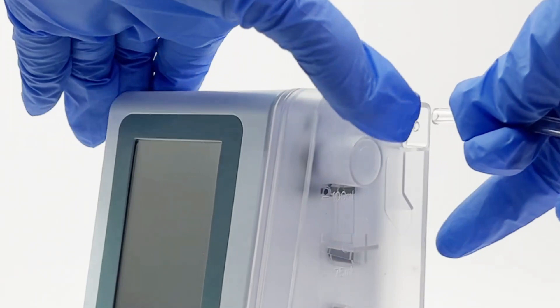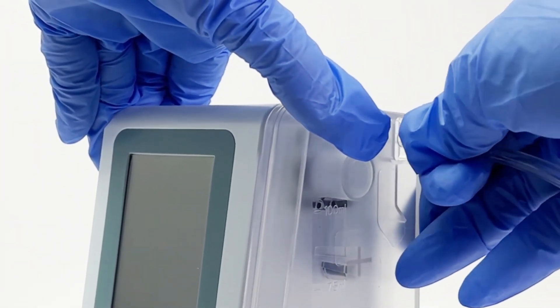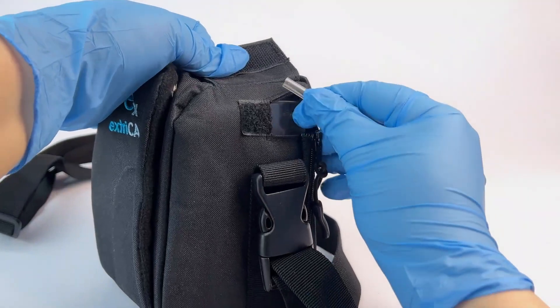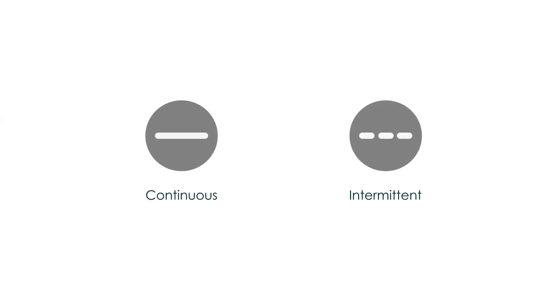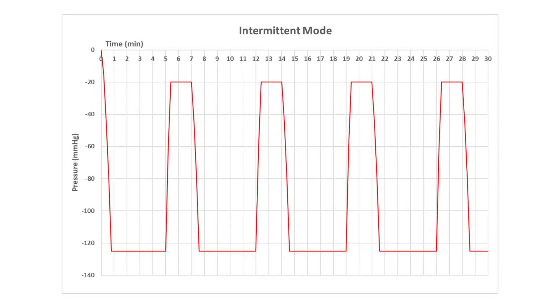Inserting the Dressing Tubing. Before starting the therapy, you will need to connect the unit to the dressing tubing. To connect the dressing tubing to the ExtraCare 3000 unit, simply push the open end of the wound dressing tubing into the inlet port of the canister, making sure it is pushed all the way in. The ExtraCare 3000 pump offers two vacuum modes: a continuous mode and an intermittent mode. The continuous mode runs the pump at the desired pressure continuously. The intermittent mode cycles the pump at the target pressure for 5 minutes, and then at a low pressure of 20 mmHg for 2 minutes.